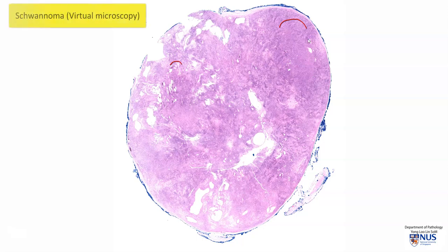Hello, this is a virtual microscopy slide of a schwannoma, which is a benign nerve sheath tumor. As the name suggests, this tumor arises from Schwann cells.